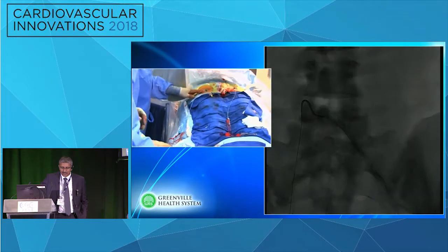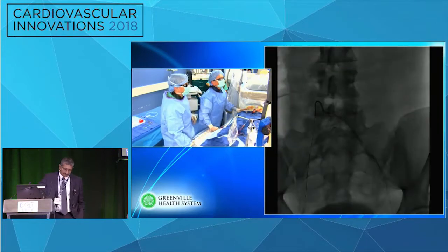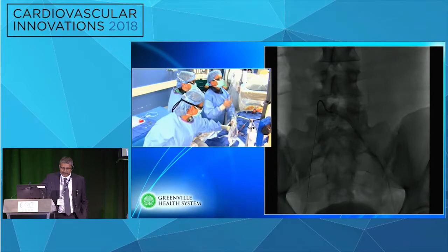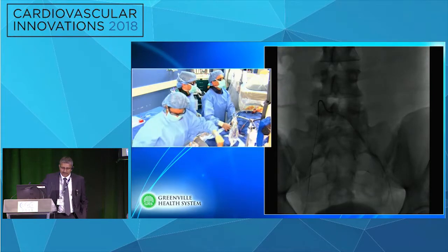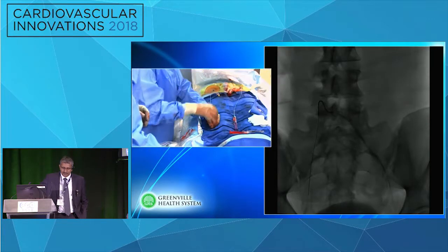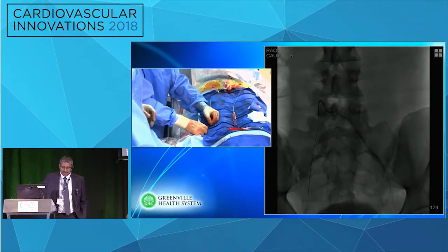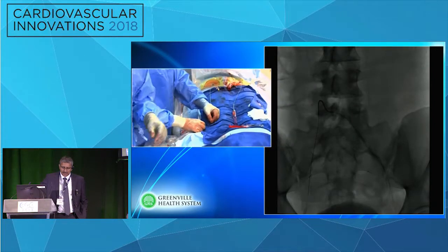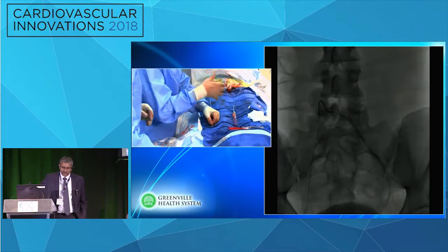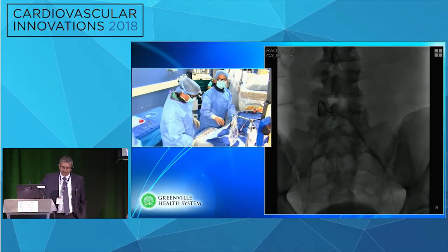Look at the iliac crest here. This is where it should be. Okay. Right here. That looks right to me. Where our wire's coming down looks right. If I can just put a catheter here, get a little bit more support. I'm trying to just push the Confianza a little bit so I don't back the sheath out. Thanks for that idea, Mehdi. And then get a little more support inside this catheter. So the telescoping method, just keep stacking one bigger or smaller thing inside the other.